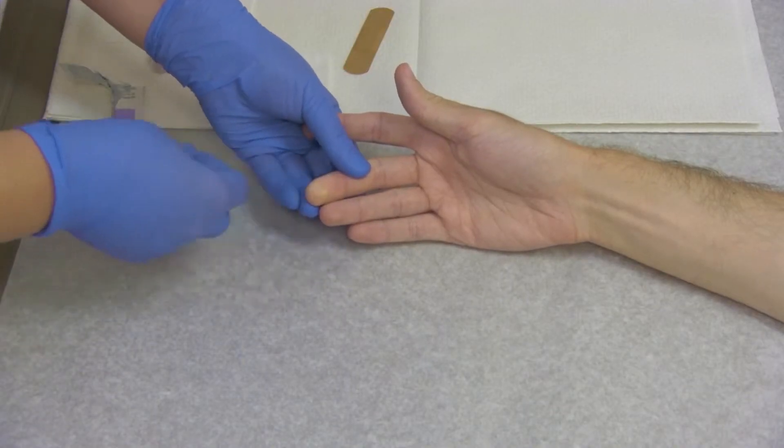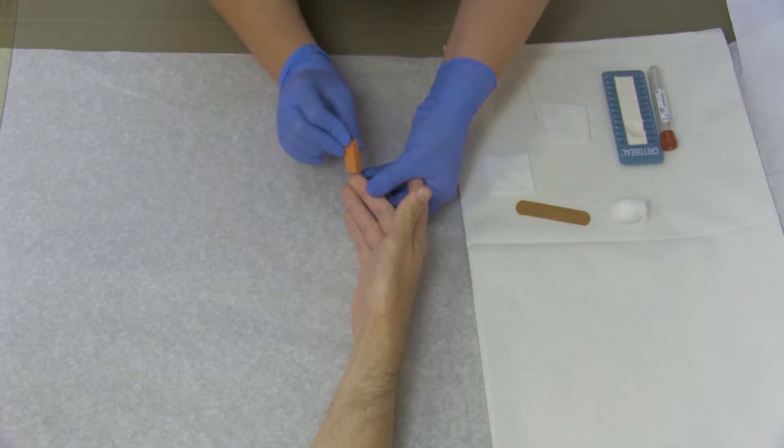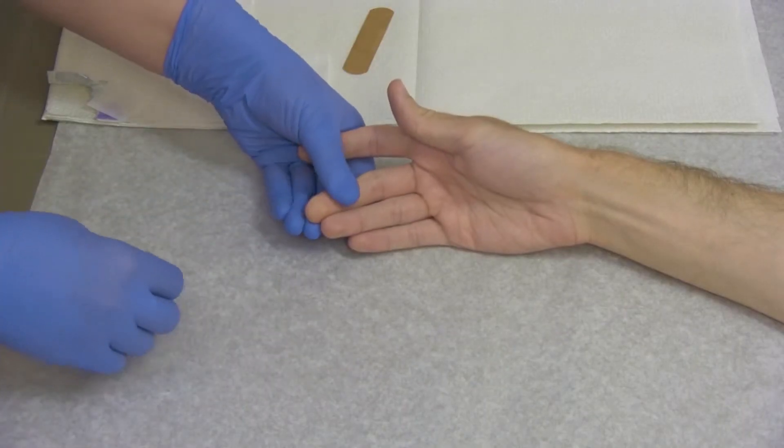Clean the site with alcohol and let it air dry. Hold the finger firmly, pulling the skin tight, and perform the puncture at the tip of the fleshy pad, slightly to the side of the center.